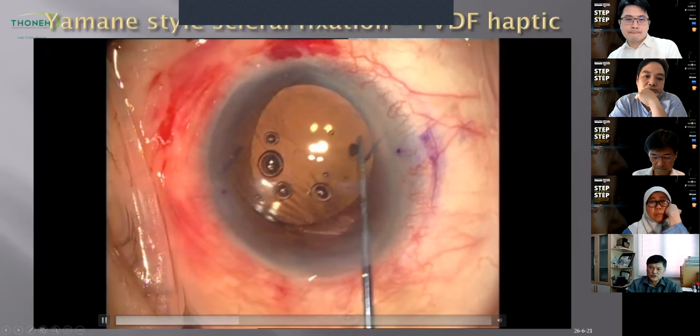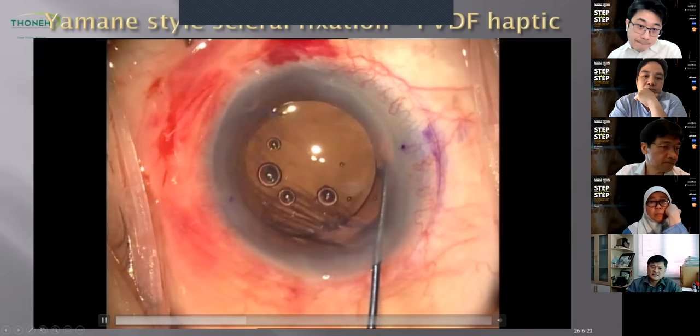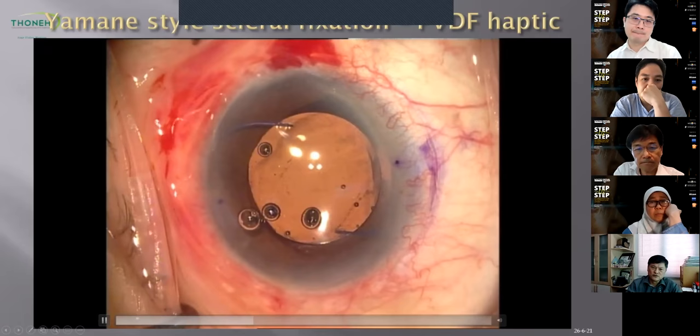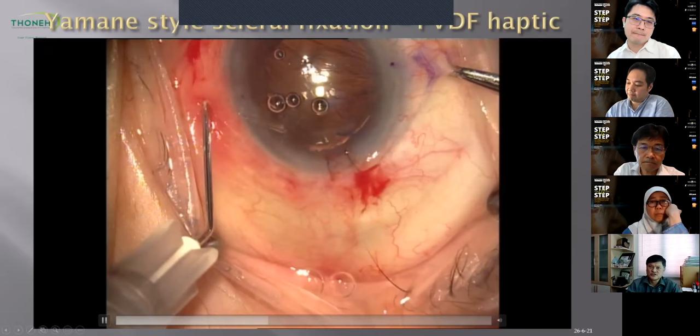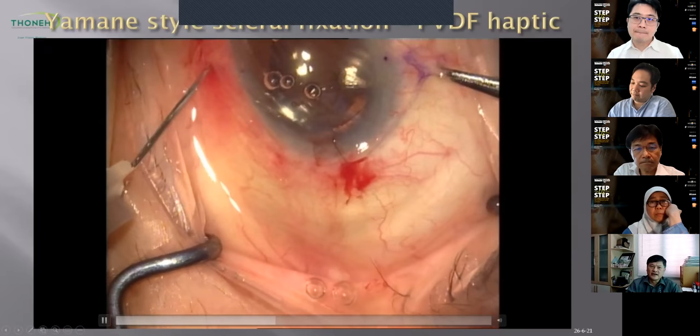After this, you can either close up the wound, then you don't have to use the infusion so often. If you do not close up the wound, then there's the time you need the infusion. Right now, I'm going to use a 27G needle trying to enter into the eye. As you can see, the eye is soft, so I have to turn on the infusion to firm up the eye first before I advance further into the eye.